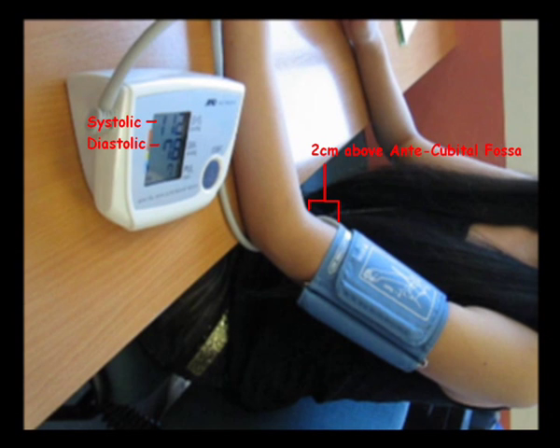Our blood pressure model shows systolic and diastolic pressure. The adult size cuff is then placed 2 cm above the antecubital fossa.